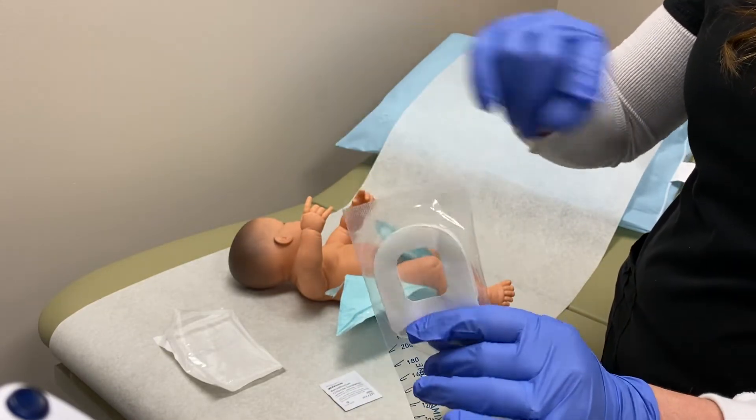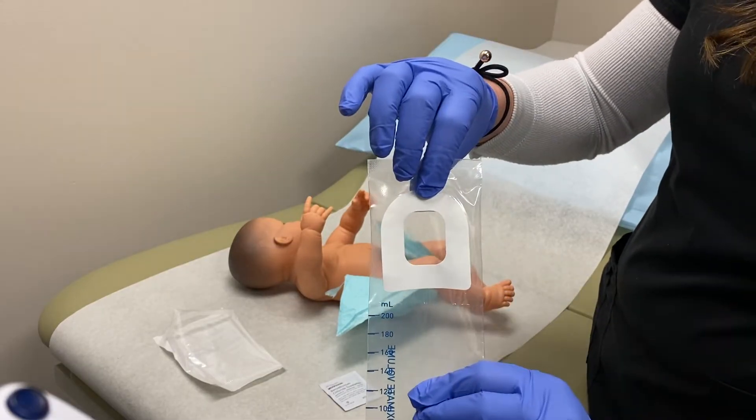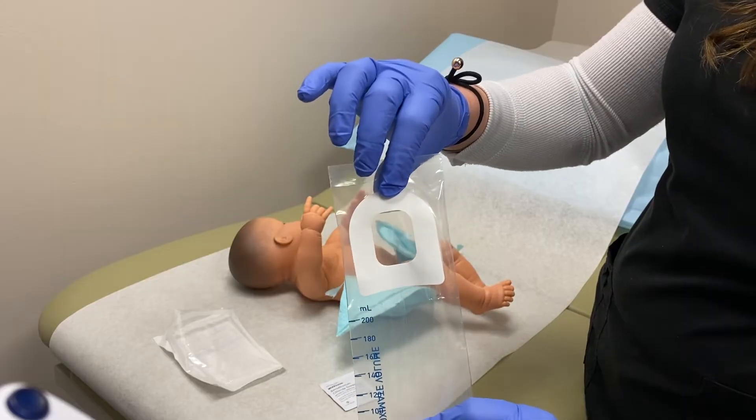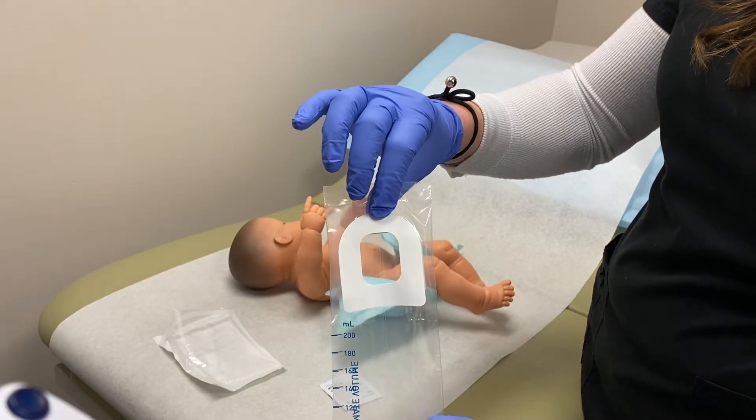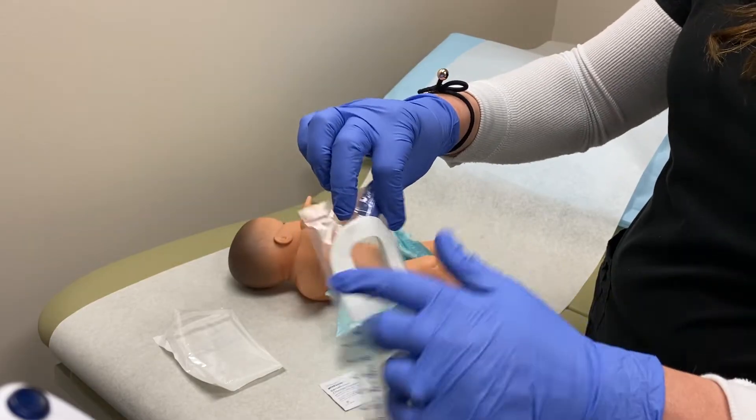In little girls, it goes over the top, near and at the top of their labia. And in little boys, it is at the tip of their penis. So this is going to go over that to catch the urine into the bag.